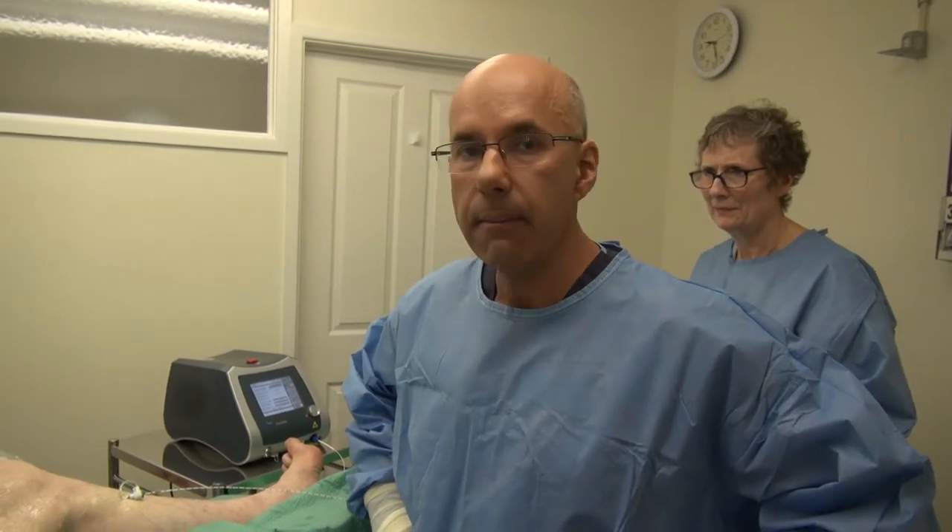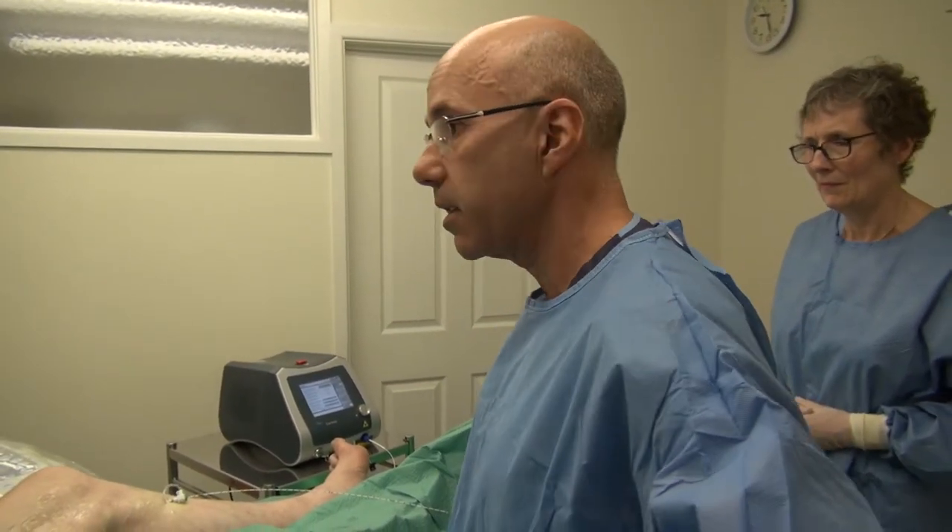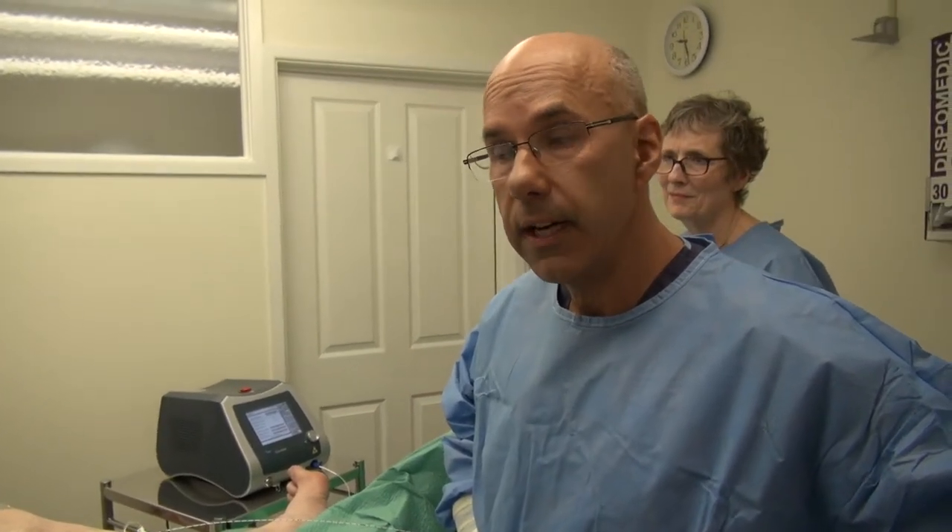So far this has all been the build-up for the activation of the laser. We've had the cannulation of the vein, precise placement of the laser fibre, and the application of tumescence — all leading up to the point where we can activate the laser and treat the vein by endothermal ablation, a procedure in which we heat the vein from the inside to a temperature at which it's closed, sterilised, cauterised and devitalised.